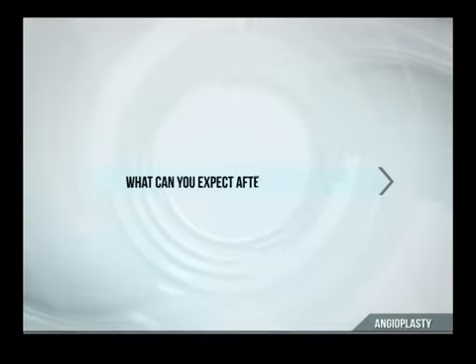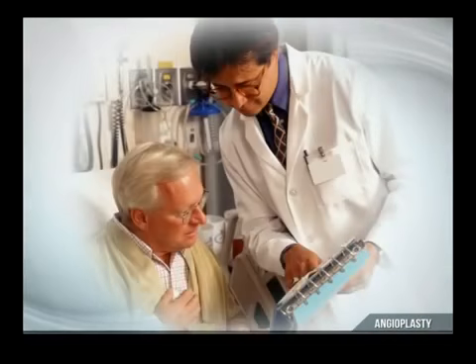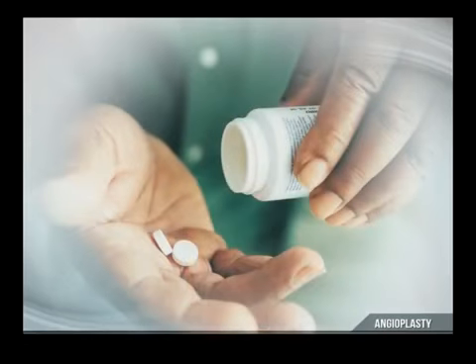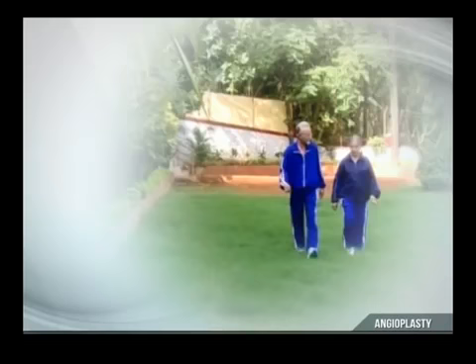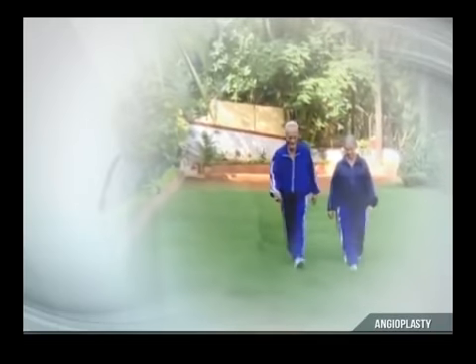What can you expect after the procedure? After the procedure, the instructions regarding the medications, care of the wound site, resumption of physical activities, etc., given by the medical team should be understood and followed carefully.